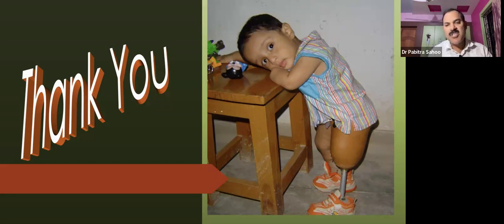But if that facility is not there, you are forced to use a 4 bar linkage knee joint, which is available under the ADIP scheme. In that situation you need an amputation at the supracondylar area with around 2 inch clearance to accommodate the mechanical knee. If that is not there, the knee joint will always be prominent in comparison to the anatomical knee joint, and while sitting the patient will feel discomfort.